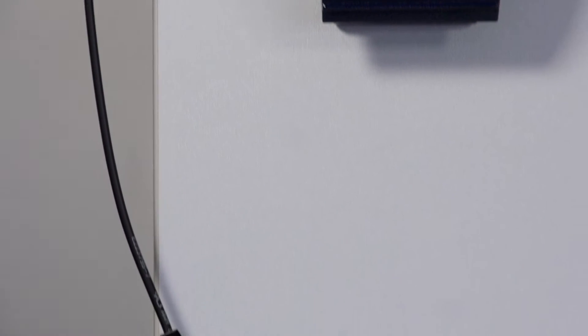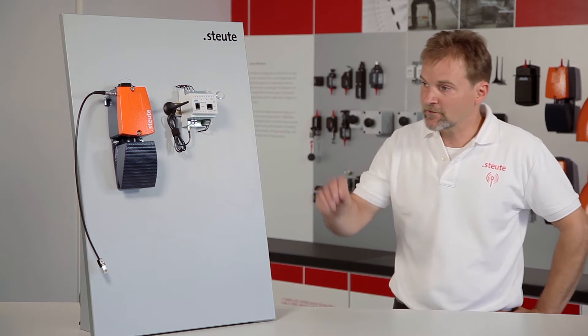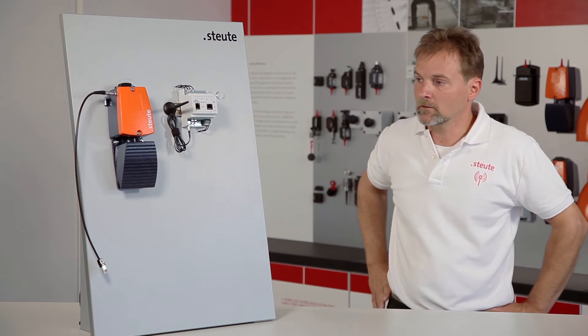In order to connect the wireless foot control to the wireless receiver, the pairing procedure must be performed, but only once. Before it can start, the wireless foot control must be fully charged using the power supply.